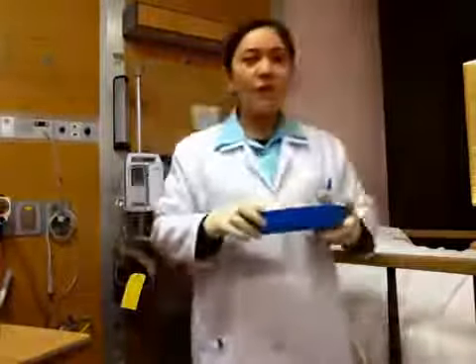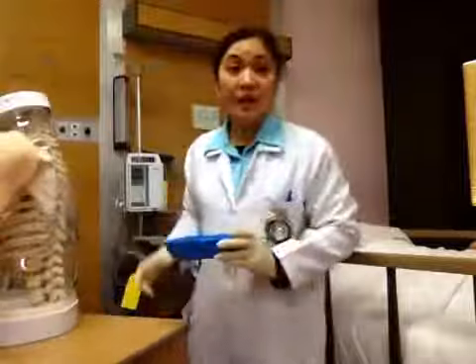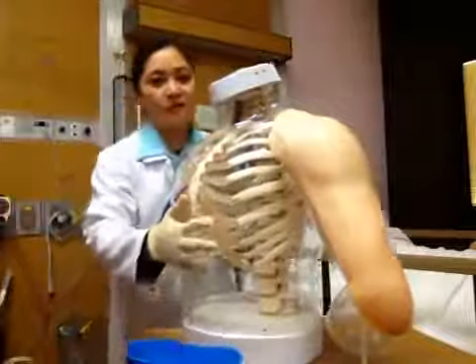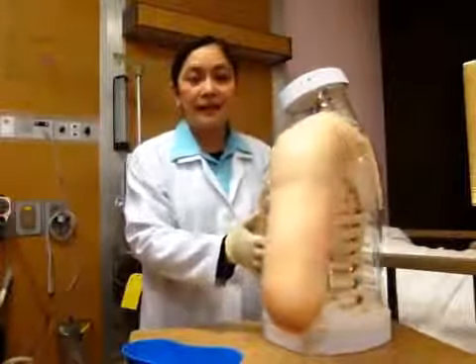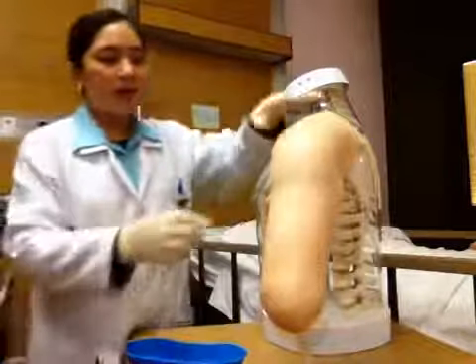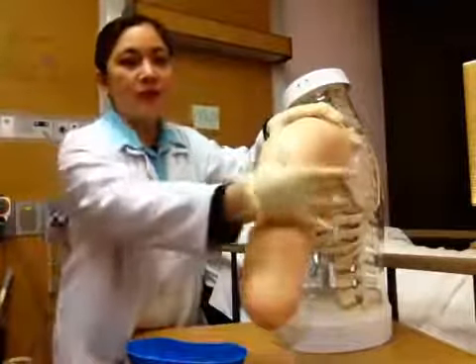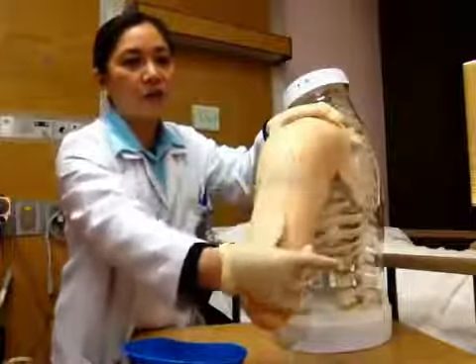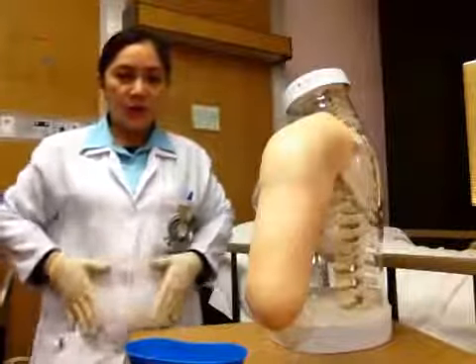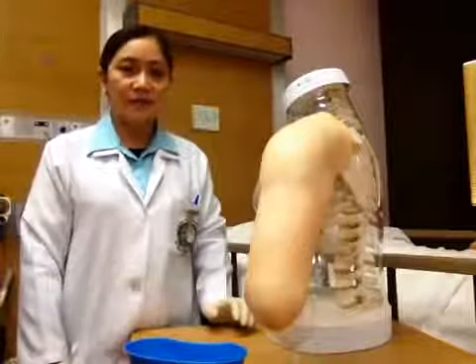Okay, so to have a better look and a better demonstration, I'm going to do it on our arm simulator. So this will be our patient, wherein I'm going to inject, let's say, insulin subcutaneously. In giving subcutaneous injection, we have different sites. We can give it to the lateral side of the patient's arm. We can give it to the abdomen, the right and left parts of the abdomen. We can give it to the lateral side of the patient's thigh.